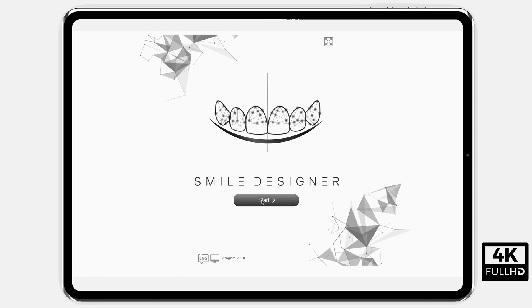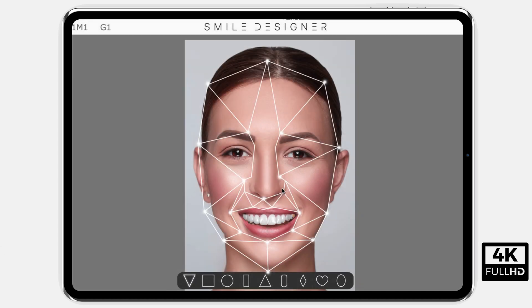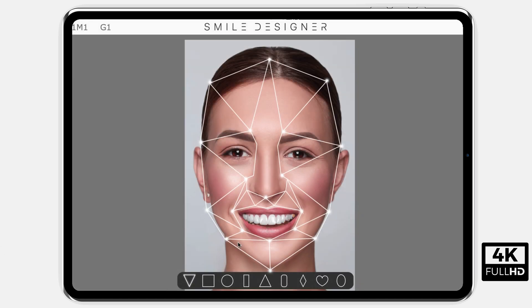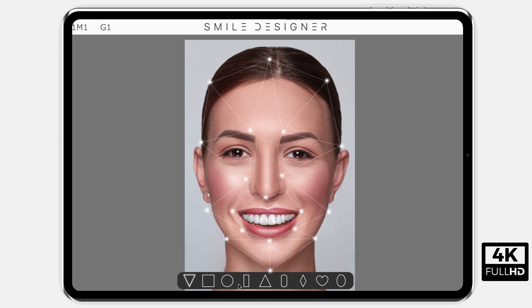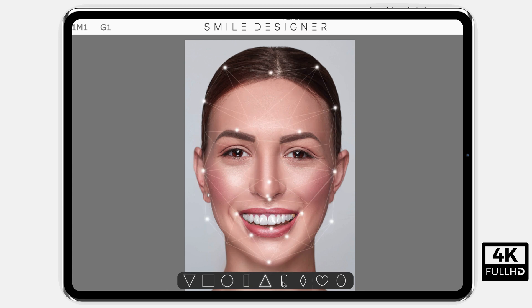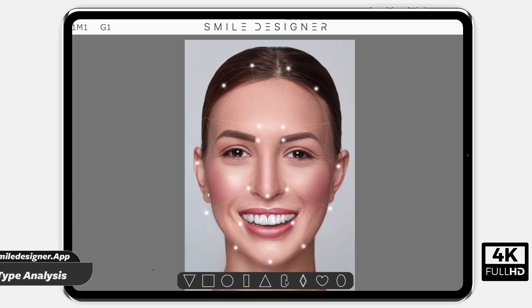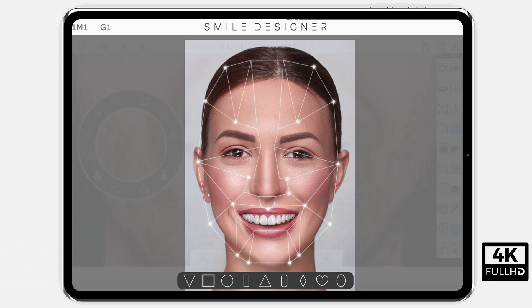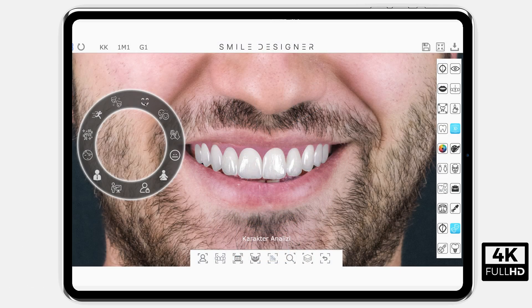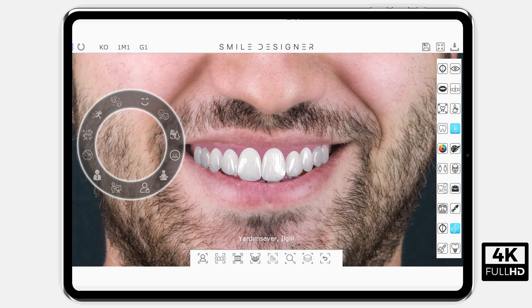Thanks to its patent-pending unique algorithm, smile design can be performed automatically within seconds based on parameters such as face type analysis of the patient, profession variant, etc.